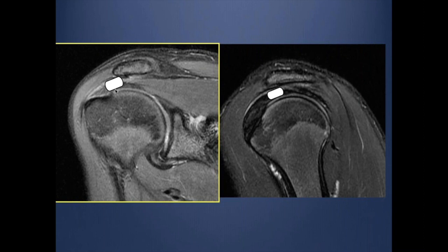If the tear extends from one surface to another — from the bursal to the articular — we call it a full thickness tear. As you see here, the full thickness tear does not have to involve the whole tendon, because the supraspinatus extends across a width. This is why we talk about the width concept of each tendon. There could be a full thickness tear but part of the tendon is still intact; we still call this a full thickness tear.